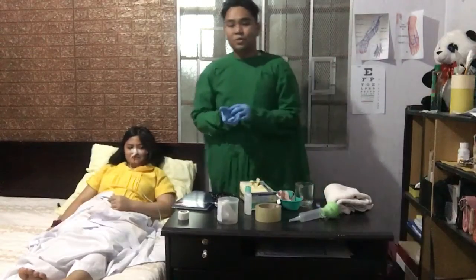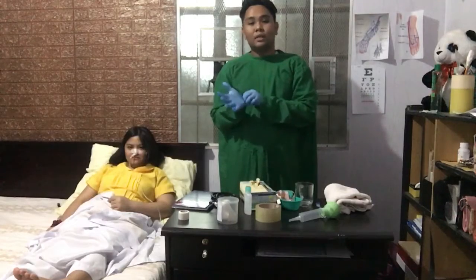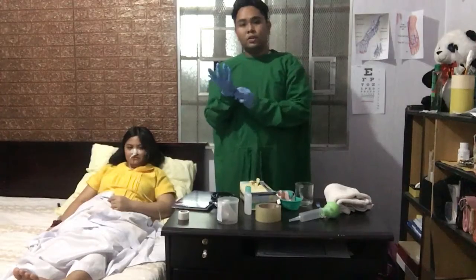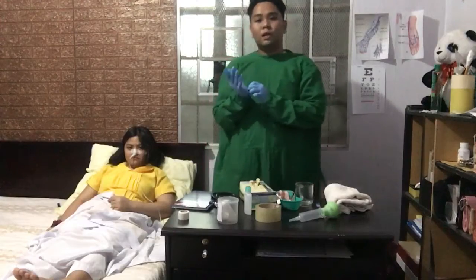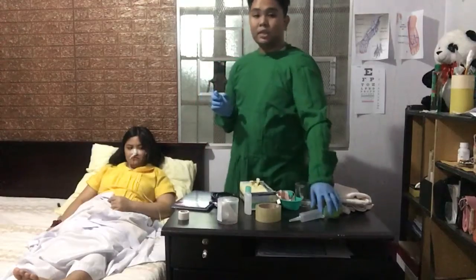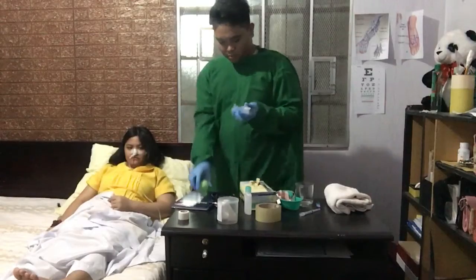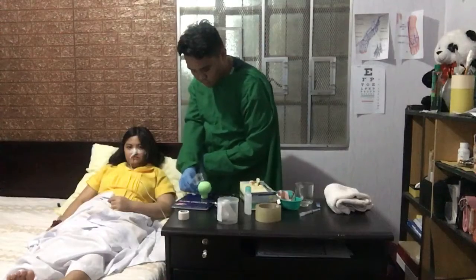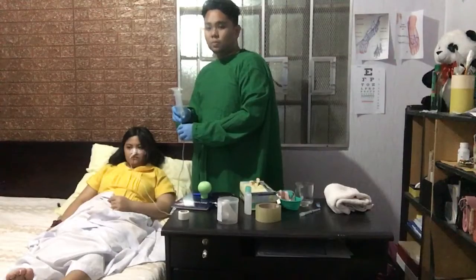Then, after that, we remove our gloves. Then, assuming we have removed our gloves, we put on gloves again before preparing the feeding formula. Next, when using a large syringe, remove the plunger from the 30 to 60 ml syringe. Then, attach the syringe to the feeding tube.